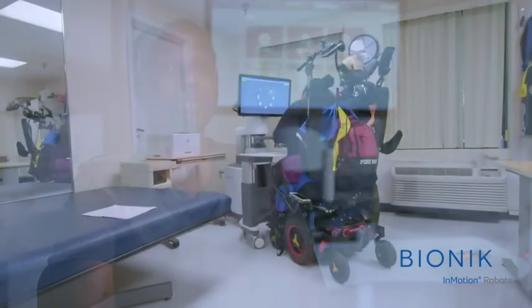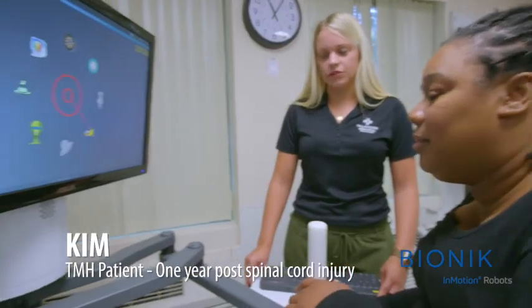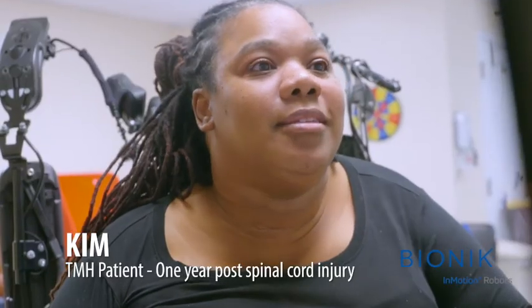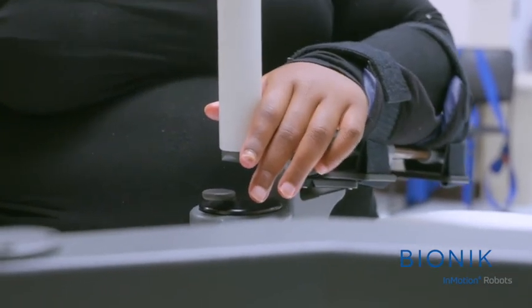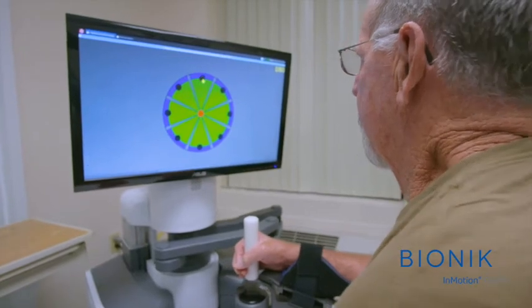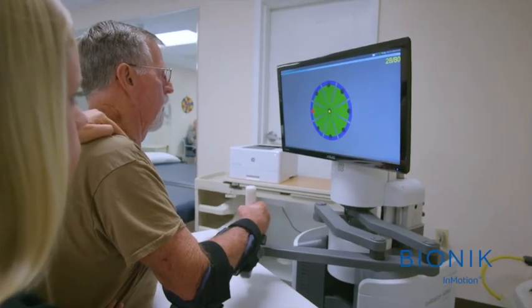One of the things that the robotic arm does is it gives the patient repetition of movement, which is really difficult for a therapist to do, 400 movements of an arm. So we're able with the arm to allow them to get 100, 300, 400 movements in one session without them being overly fatigued and of course the therapist being overly fatigued.